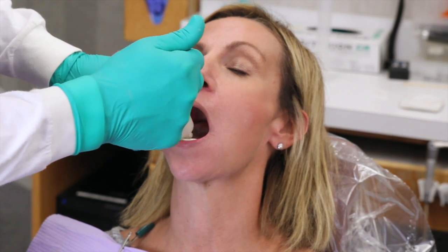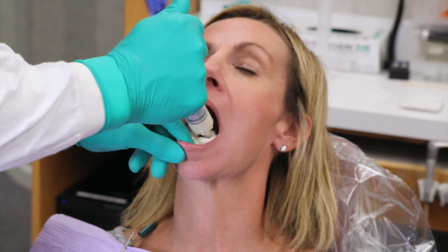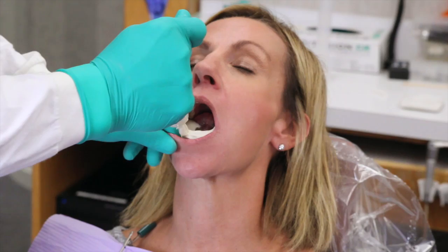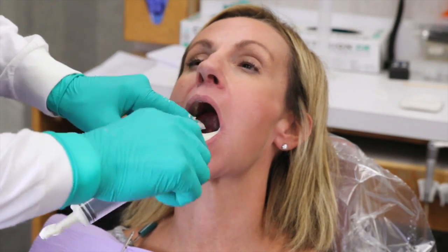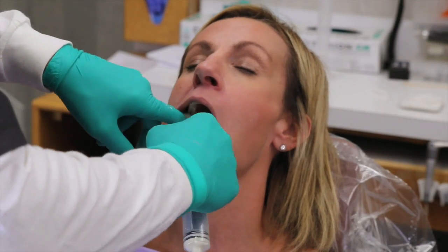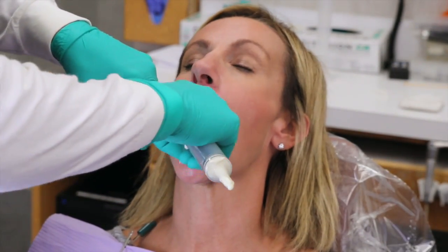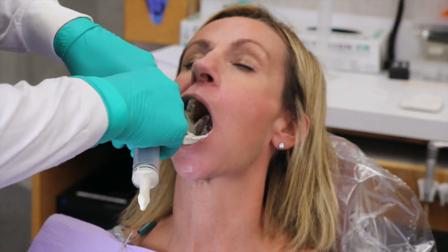And now curl your tongue back. Great. We'll get the sublingual areas. And then it kind of overflows, but we'll go on the occlusal table here. And then once again, we're going to wipe, wipe, wipe, wipe. I'm trying to wipe not just into the occlusal tables, but also I like to get those gingival areas, the whole lingual buccal contours of the whole tooth.